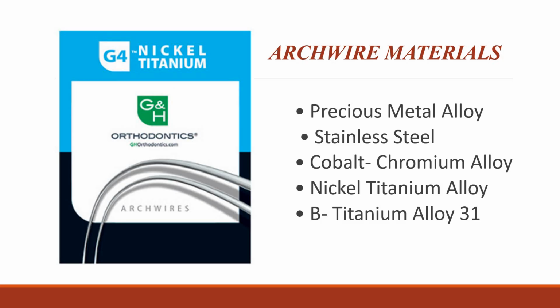These different alloys all offer a variety of physical properties which can be defined. The ideal properties required of an orthodontic arch wire will depend upon the stage of treatment and the type of tooth movements being carried out, and no arch wire material will offer all of this together. For this reason, a number of different arch wires are required during a course of orthodontic treatment, and this will vary in both the type of metal used and the dimensions.